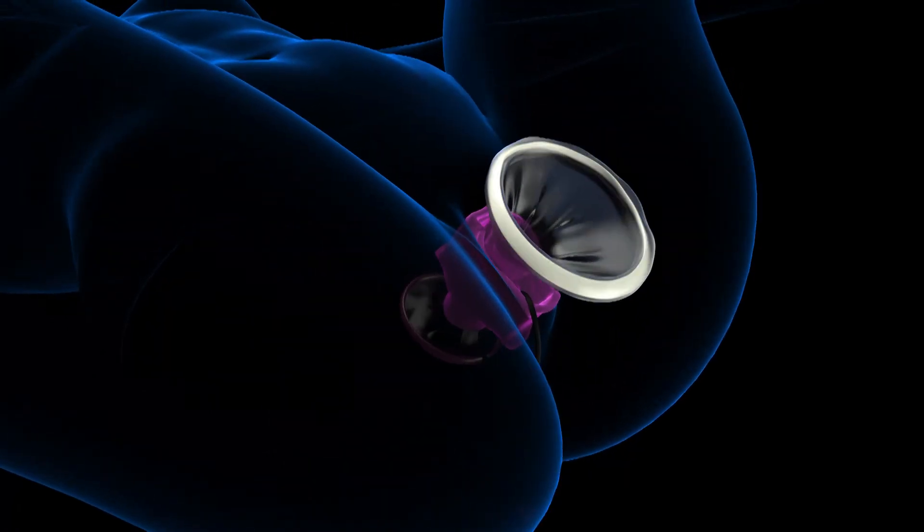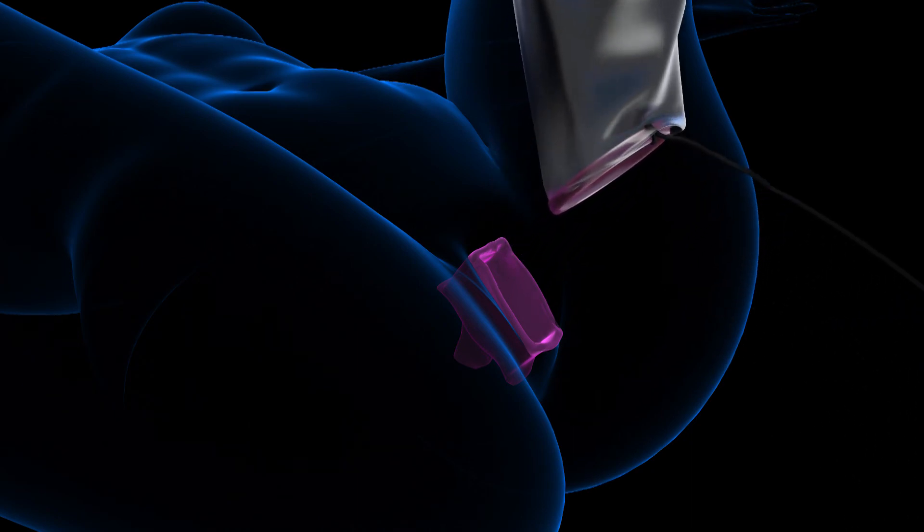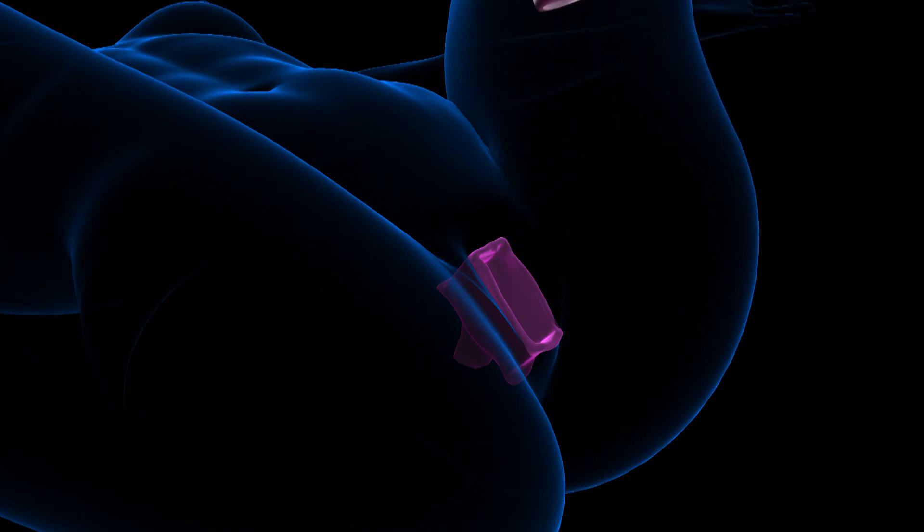The Alexis retractor outer ring is rolled outward until loose. The Alexis retractor can then be removed by grasping the tether and pulling outward. The colpotomy is closed using an absorbable running suture.